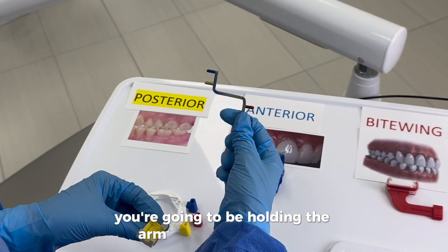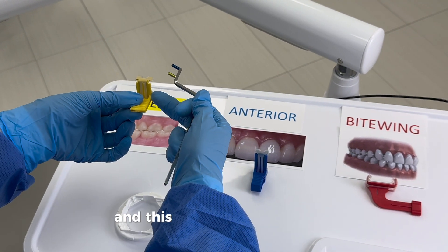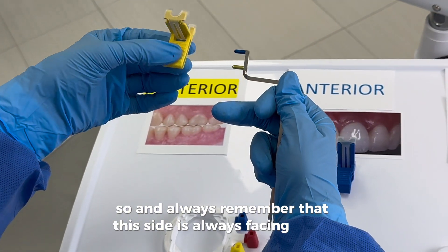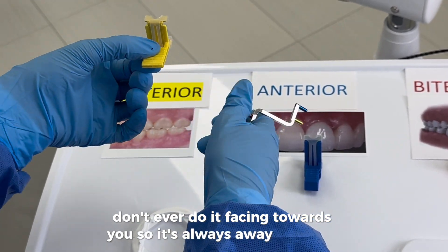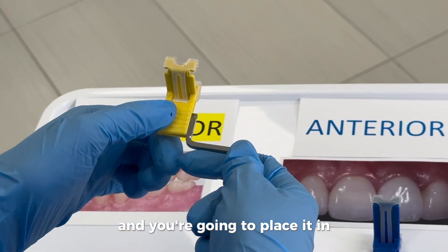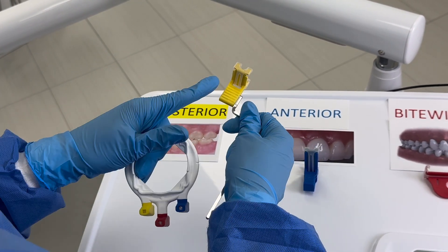Let's start with the posterior yellow bite block. You're going to hold the arm with your right hand and the bite block with your left. If we put the arm on the right, up is going to be upper right. Always remember that this side is always facing away from you — never facing towards you. The prongs are facing the bite block sideways and you place it in.